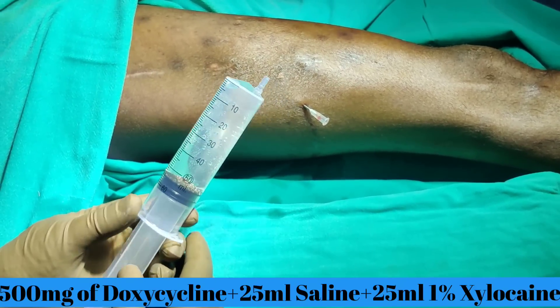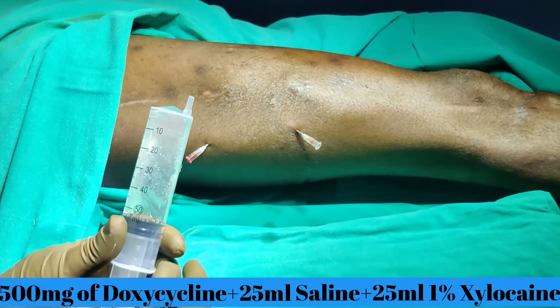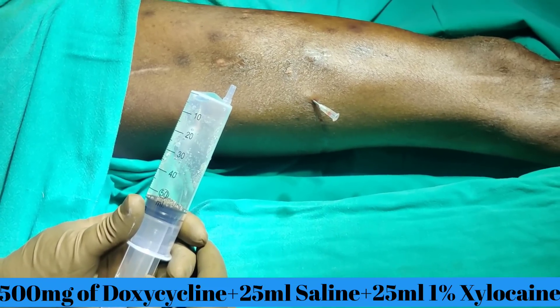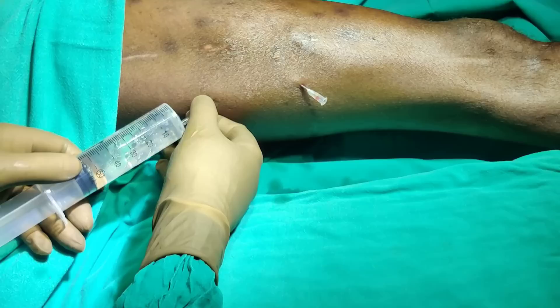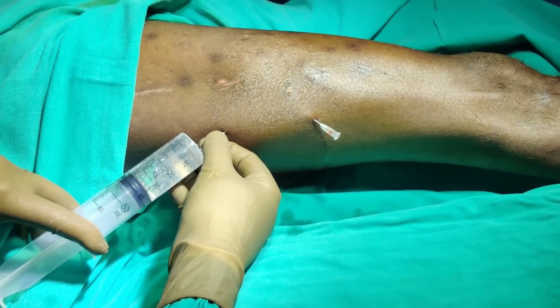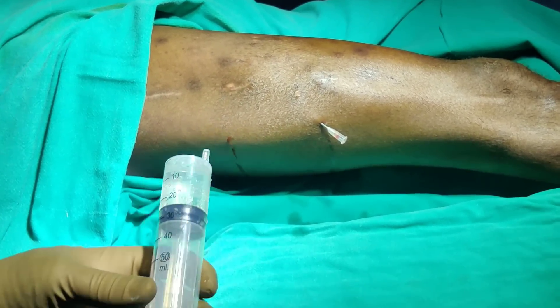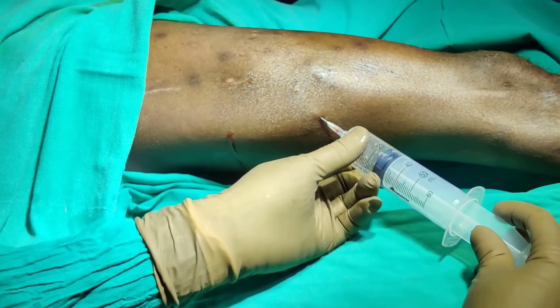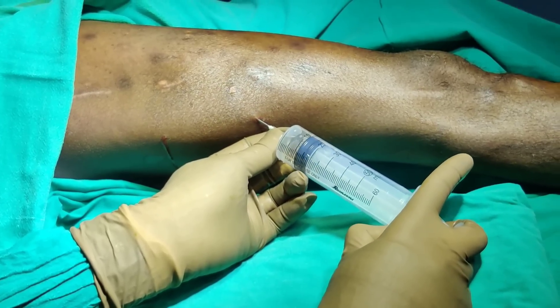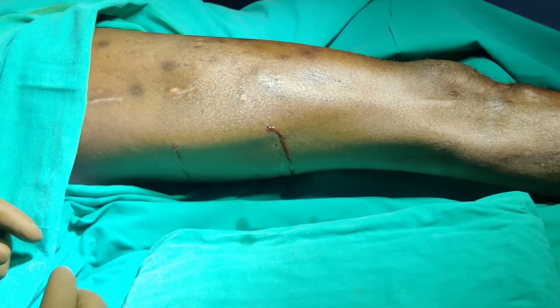Our sclerosant is 500 mg of doxycycline, 25 ml of normal saline, and 25 ml of 1% xylocaine. Leave the needle inside and inject it into the same space — you can see the swelling becoming worse. Inject from one side and leave it for roughly 30 minutes. Some people leave it longer, but I leave it for around 30 minutes before revisiting.